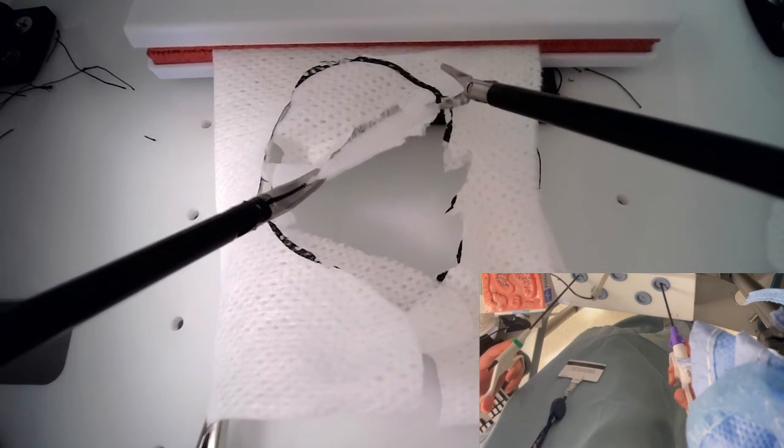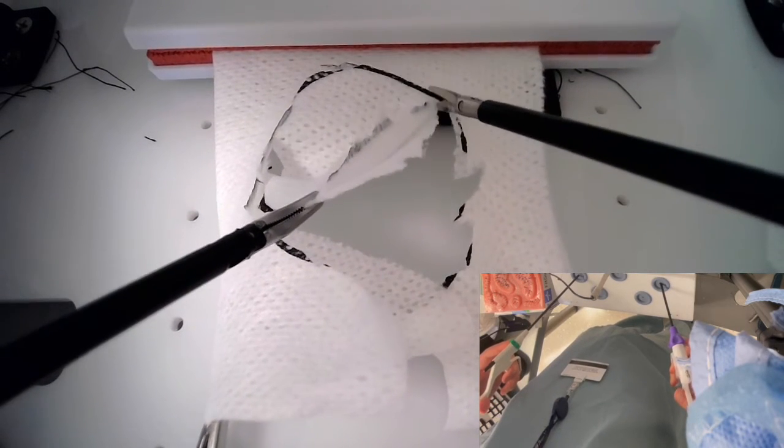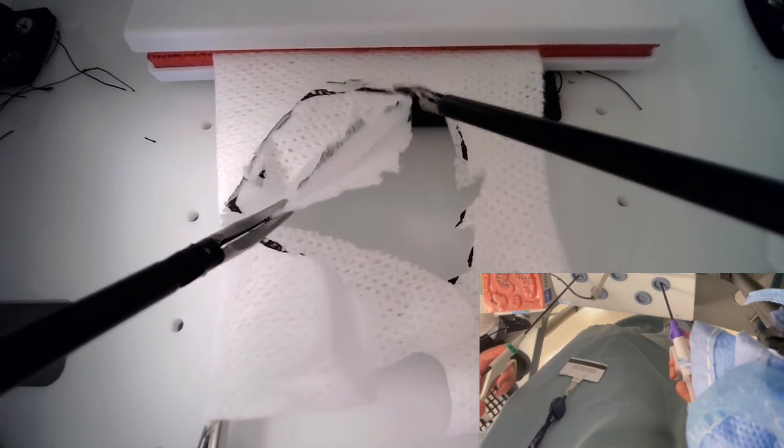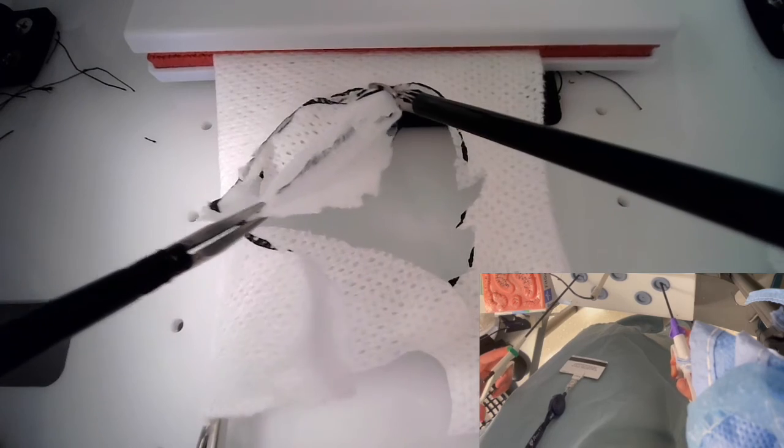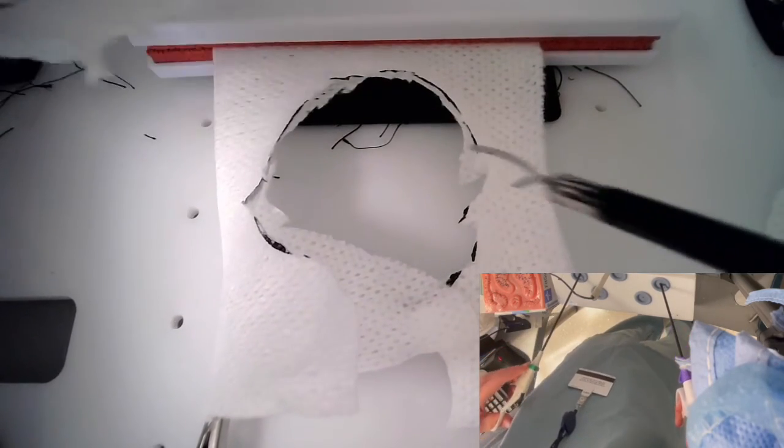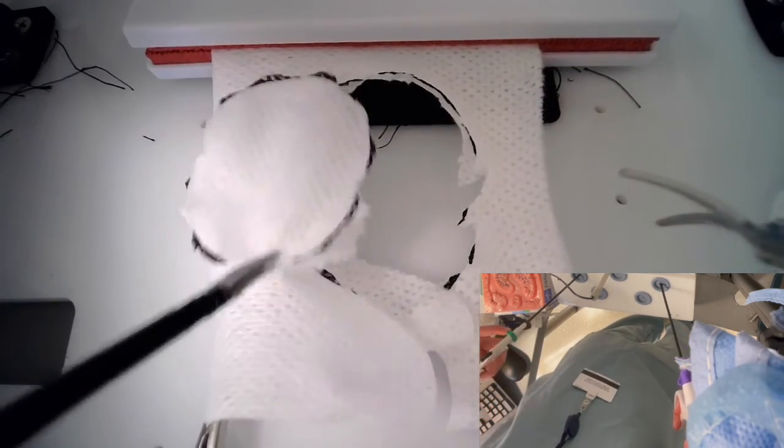Always make sure the gauze is taut and your cutting is going to be effortless and much easier to perform. Thank you.